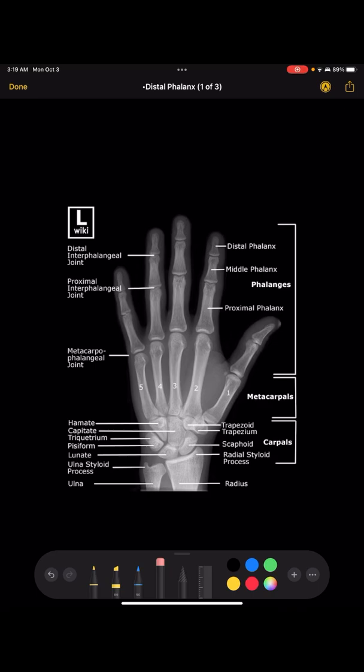This first picture is called a PA hand — the hand is flat on the board and you take a picture. You center right at the third MCP, which gets the entire hand perfectly centered. You also want to make sure that all the joint spaces in the fingers are open, meaning they look really dark because you can see right through the joint.